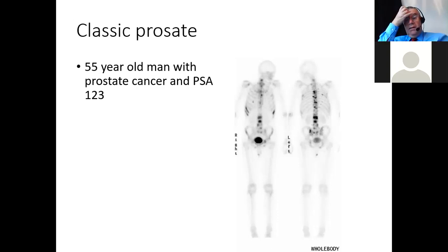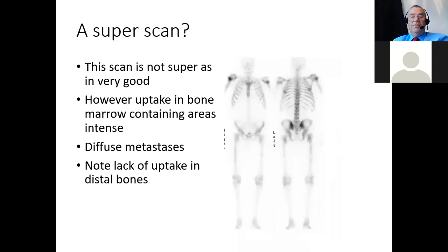PSMA scanning will cost around $3,500 and is only available to about 10 hospitals in the UK. So as you can see, at least for the moment, the majority of patients are still being imaged with bone scintigraphy on the understanding that we may not be as sensitive as they are with PSMA PET.